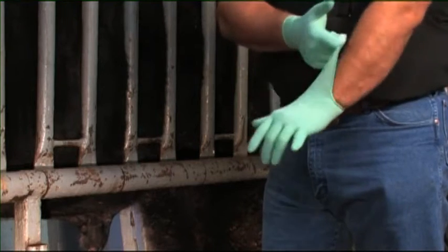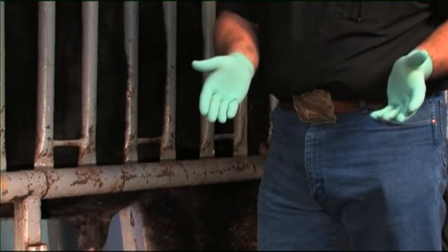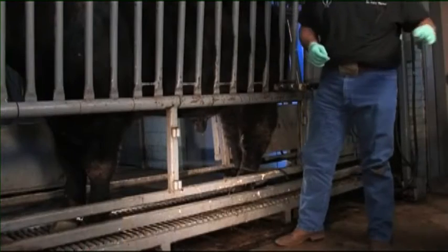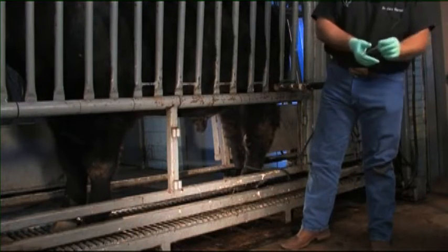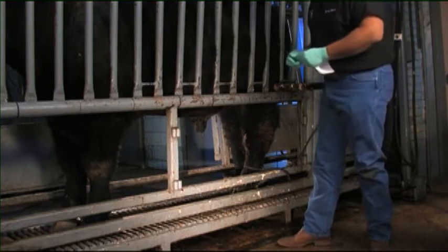The reason we put on gloves for every bull we test is to reduce the possibility of cross-contamination between bulls, particularly when PCR testing is involved. Now we're going to get our scissors and a paper towel in order that we can trim the sheath hair from the sheath.